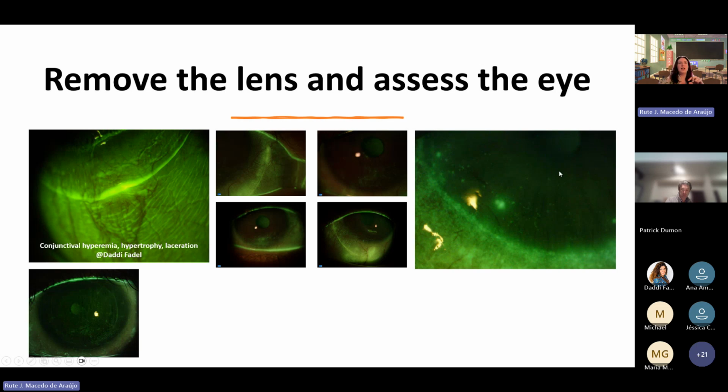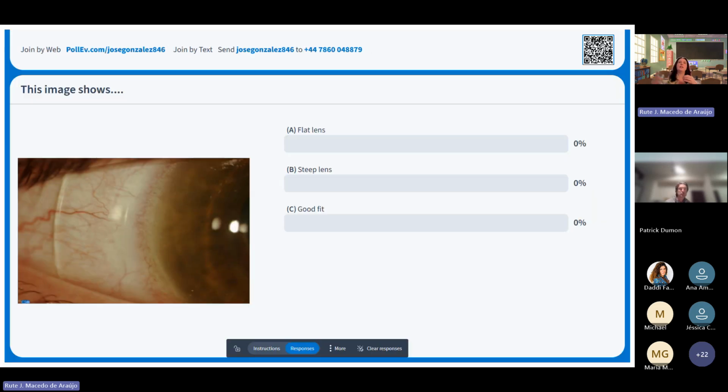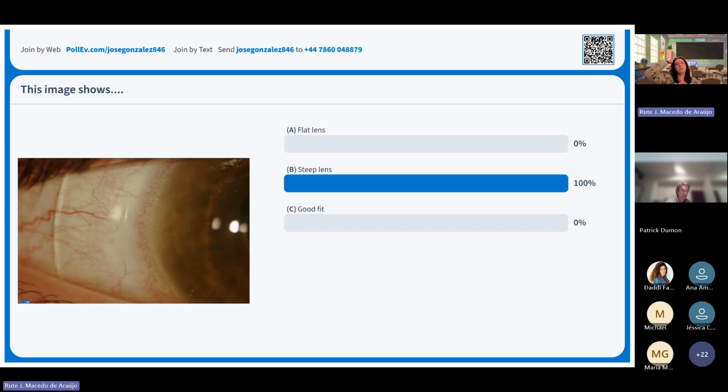So if the lens is very tight, if the lens is bearing on the limbus, etc. So, what do you think this image shows? This is a flat landing zone, a steep landing zone. This is a good fit. What do you think? Okay, steep. Anyone has a different opinion?